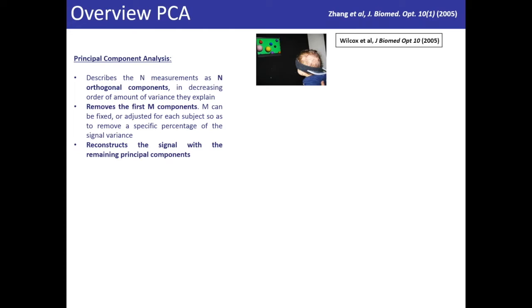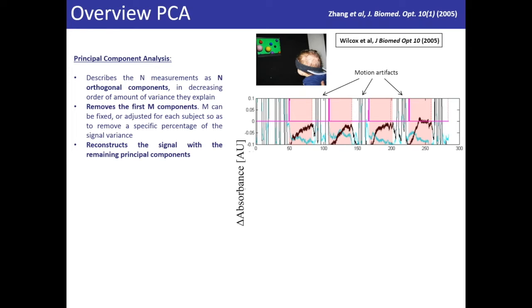This study by Teresa Wilcox is with 6-month-old babies. For this age group, the dominant source of variance is typically motion artifacts. I'll show you a data set here, and you'll understand what I mean. In the study, babies are watching a visual display, marked here as these red patches. Here they are watching the display, and here are the rest periods in between. In these rest periods between visual displays, they start to move their heads, of course, and in the signal we see these giant motion artifacts. They move their heads, which we probably don't see here, but this creates a lot of motion in the signal.